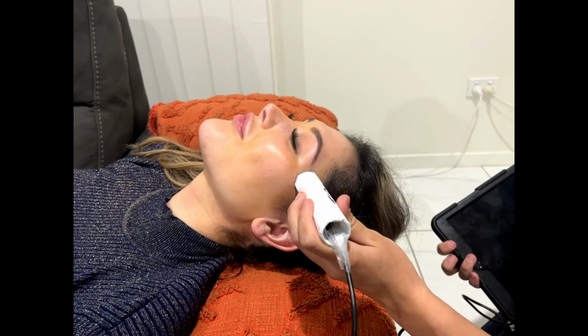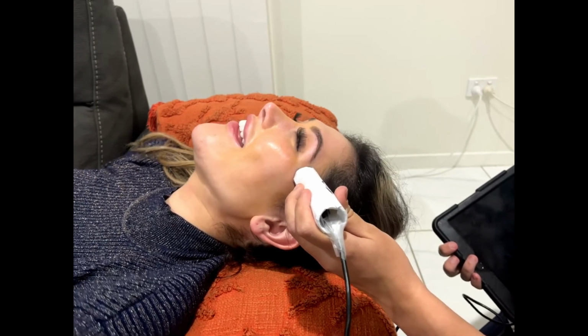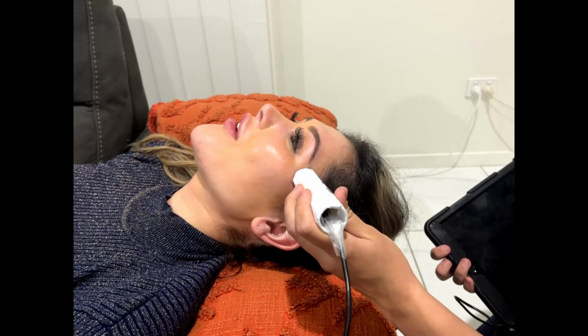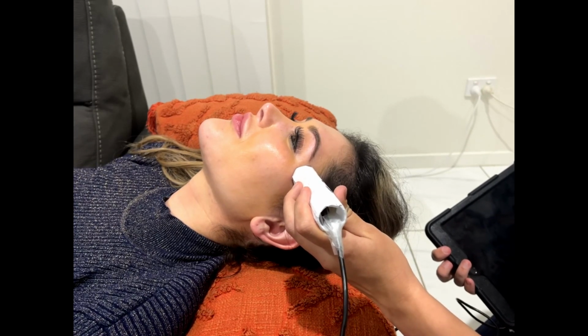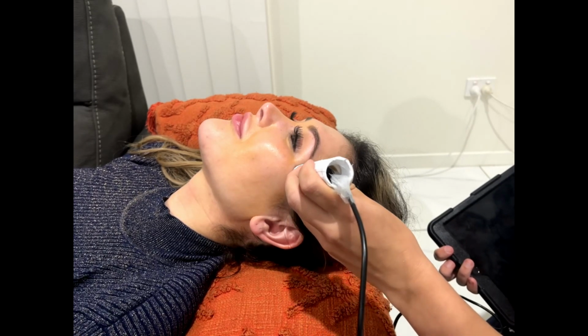Studies conducted by Gao et al. 2022 also noted that transcranial Doppler was comparable when assessing for ischemic cerebral disease. It has also shown promise in identification of large vessel occlusions. Further, this point of care device may assist clinicians in identifying transportation to appropriate receiving facilities. The patient's spectral waveform, blood velocity, and pulse index were as follows.